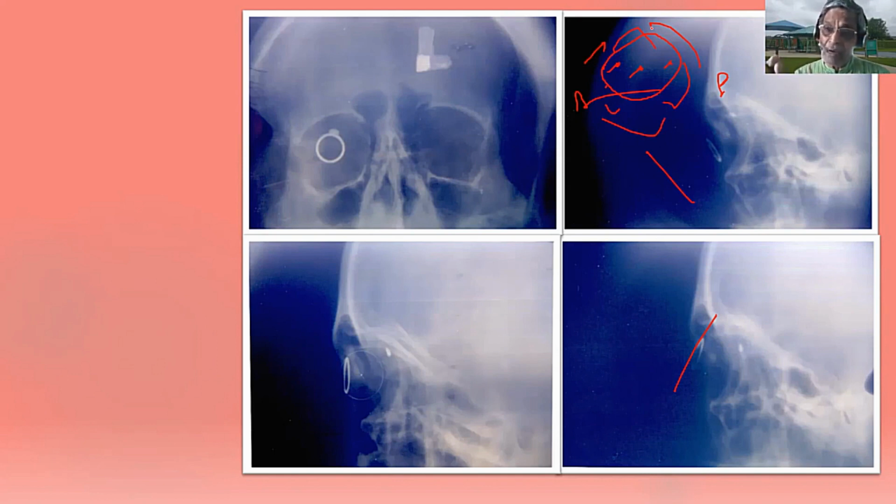One more drawback here also. They will ask you, what's the drawback here, doctor? Your answer, sir: sometimes the foreign body is at the center of rotation itself. When I move up or down, there is no movement. That means a foreign body at the center of rotation itself will not appear to move during movements of the eyeball.